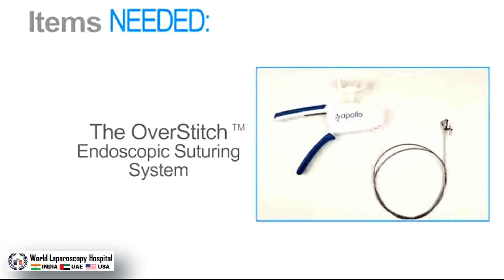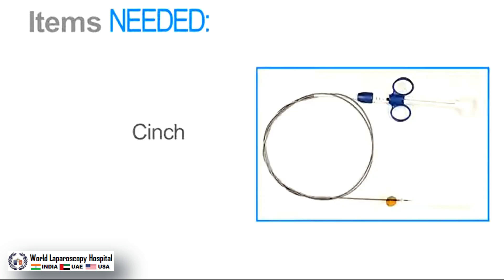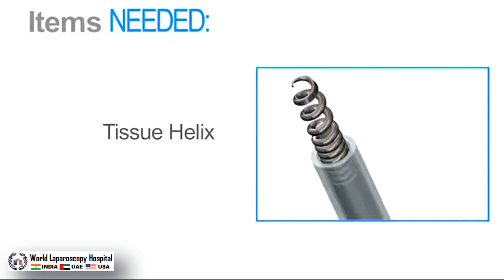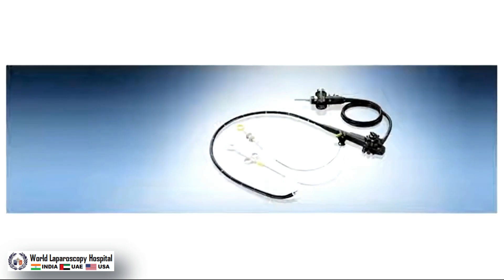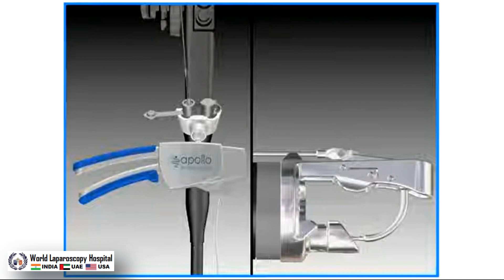The items needed for a case include the OverStitch system, which includes the needle driver and the anchor exchange, polypropylene or polydioxanone sutures, cinches, a tissue helix, and an overtube. An Olympus double-channel therapeutic gastroscope is required. Depending on your procedure, additional accessories may also be required.